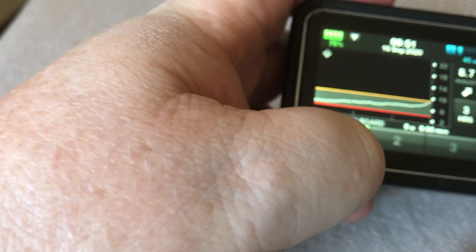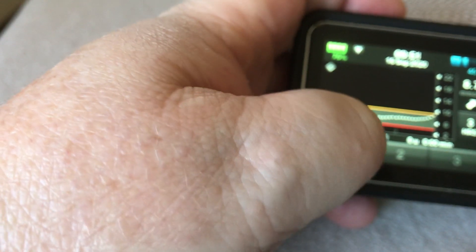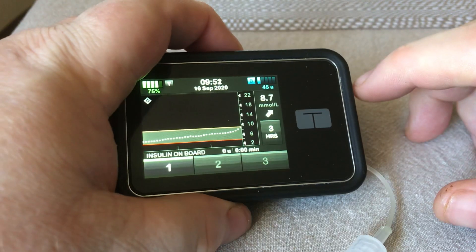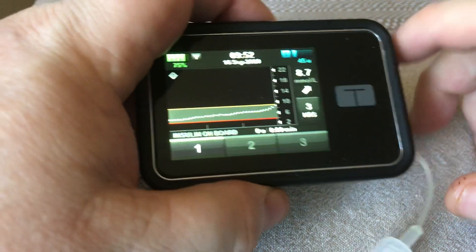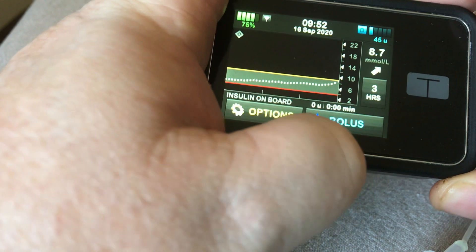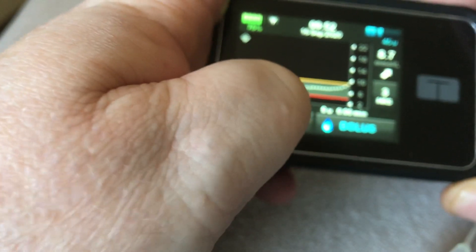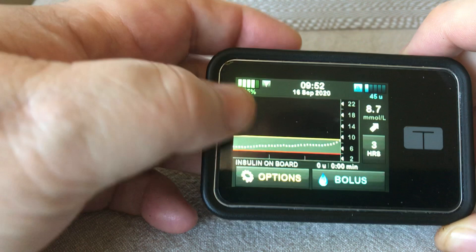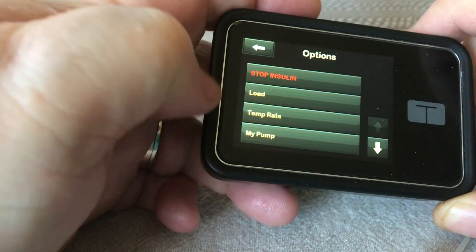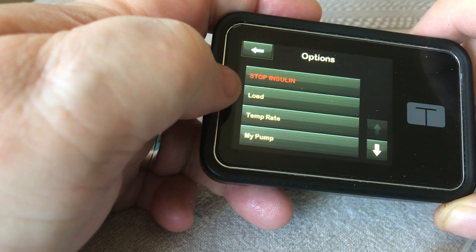Oh yes, there's breakfast — I'd already had breakfast but forgot to film this beforehand. Anyway, reload time. So this pump's got Basal IQ on it, hence the little diamond up there. So the options menu has the load process on the front screen.